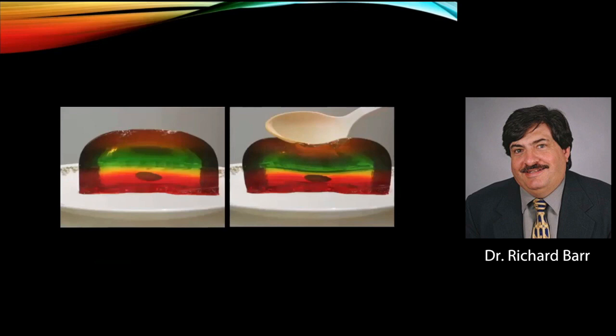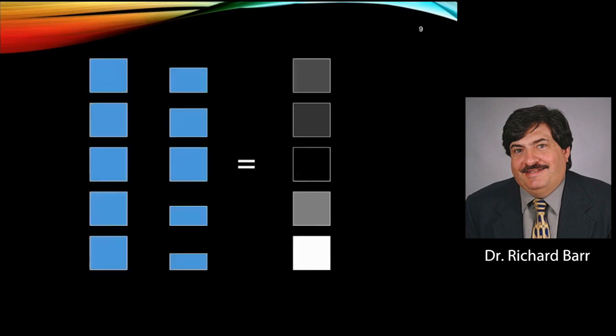And this is my typical physics slide, an almond in a bowl of Jell-O. And we're going to apply a force here with the spoon. And as we apply the force, you'll notice that the almond doesn't change shape. It's stiff. The Jell-O, particularly near the top where the spoon is, changes shape a lot, and it's soft. And that's all that we're doing. We're looking at the frame-to-frame differences as that force is applied and released, and to see how the tissues change. The more they change, the softer they are. The less they change, the stiffer they are.